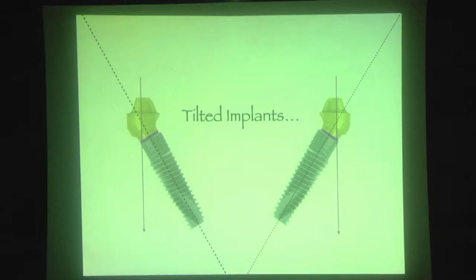So we use a bone profiling method for this bone reduction, okay? Selective bone reduction. In this part we made a bone reduction, and in the other part we did no reduction of bone. And again, with one tilted abutment, it then comes out straight, like this, and the structure can hold the whole system well.